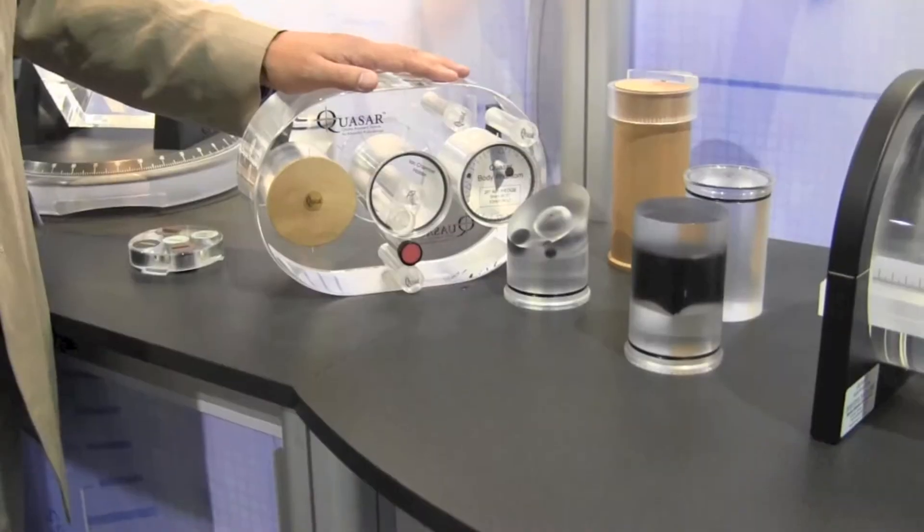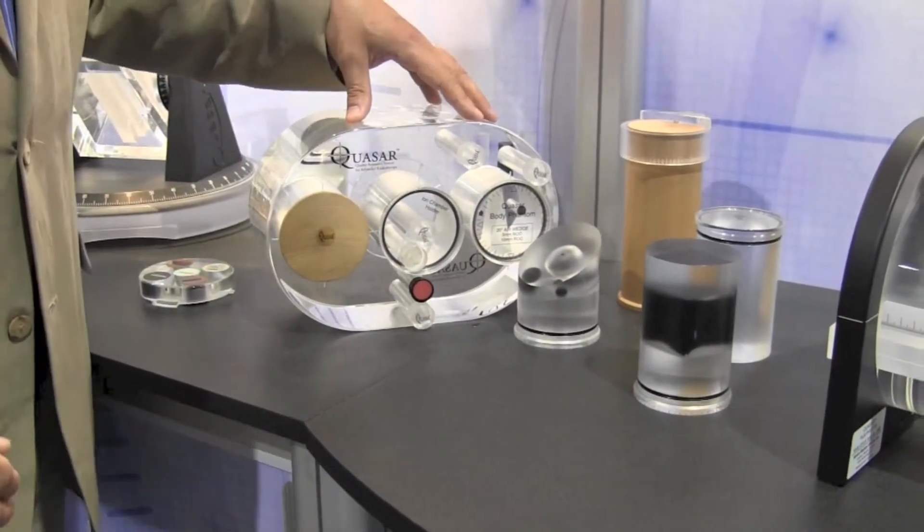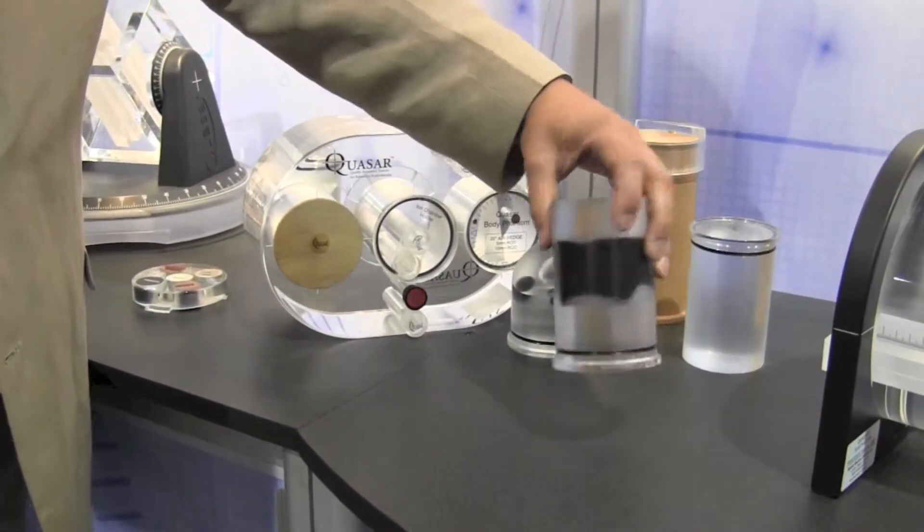Hi, I'm John Miller of Modus Medical. This is the multi-purpose body phantom. There are a series of inserts for non-dosimetric testing. You can see some of them here.